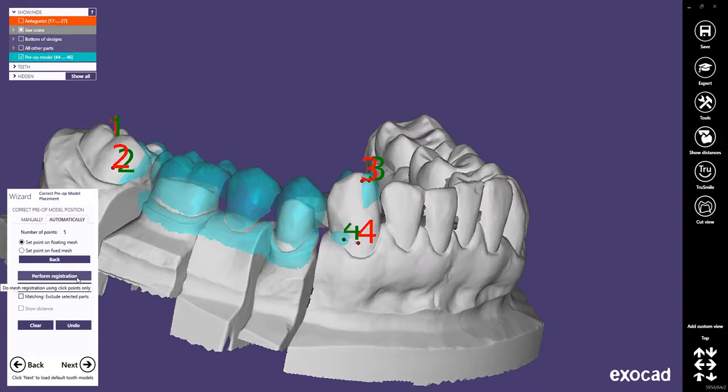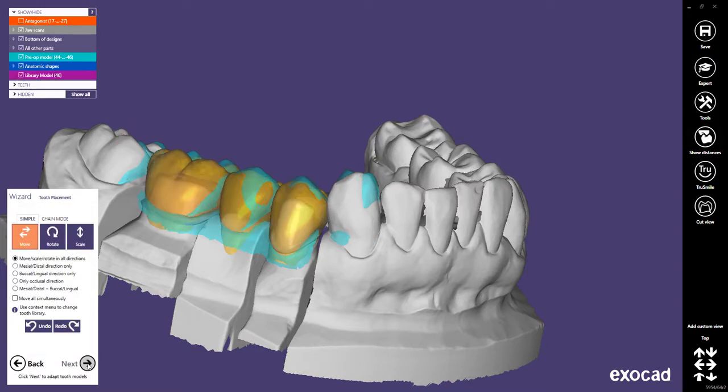The following construction is performed the classic way you should be familiar with: loading tooth models, adapting, and freeforming them. Therefore, we will start again with the Copy Tooth dialog to demonstrate another very interesting feature.